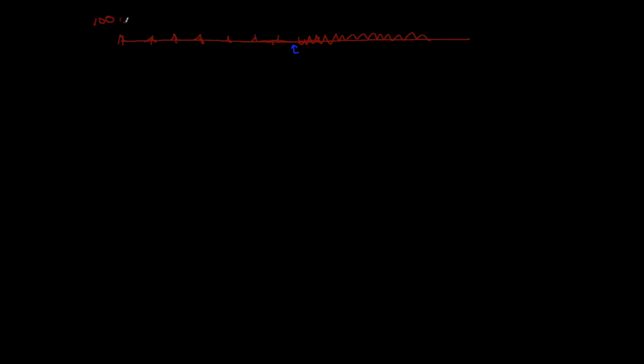So your safeguard around that is to have the patient paced at VVI with the understanding that you're completely overriding things to begin with, but you expect some activity to come back and you don't want to create some kind of R on T phenomenon.